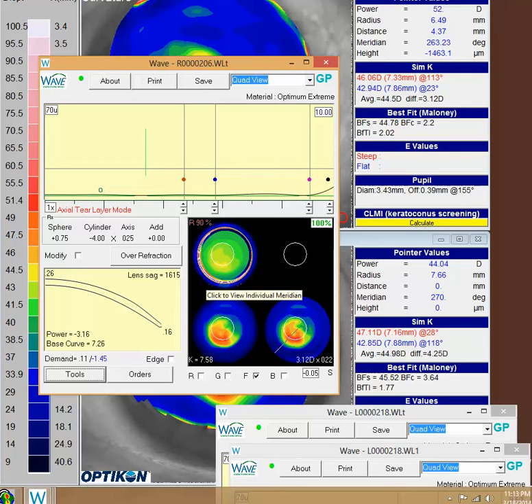As you know, it's hard enough to get these lenses comfortable on these keratoconus patients. When it comes to power, what you may have going on here, and this has happened to me in the past, most of these keratoconus patients are wearing spherical lenses. Now I've gone to a freeform design, which is a nice idea, but as you mentioned in your clinical request, you weren't sure on this refraction. So what may be happening in this case, you've got imperfect refraction due to the weird cornea.